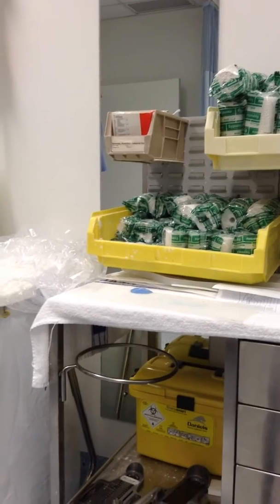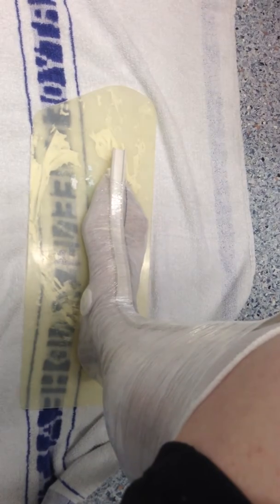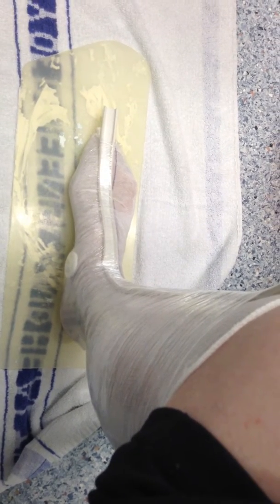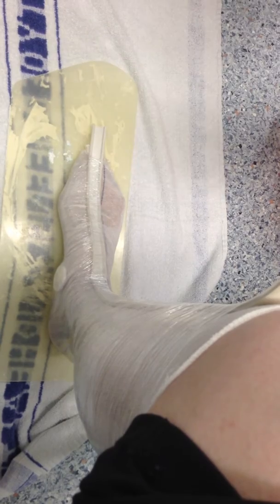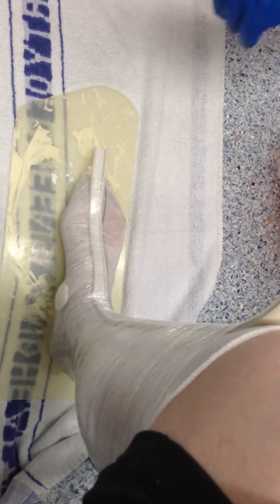For anyone wondering what this video is — this is Jodi G from jodysjourney.com. I'm doing a video for you of the plastering of my leg. We're just doing up a new cast. For my leg, I have peripheral neuropathy of the S1 nerve, and I have dropped foot and weakness in the right leg due to scarring of the S1 from radiotherapy and past tumours. However we're all well now and we're managing it with a cast and with an orthotic called an AFO.